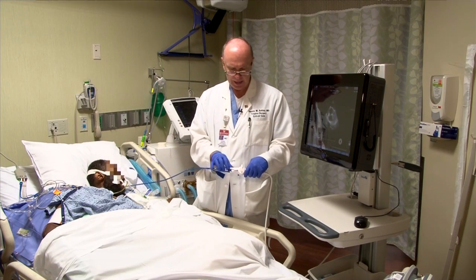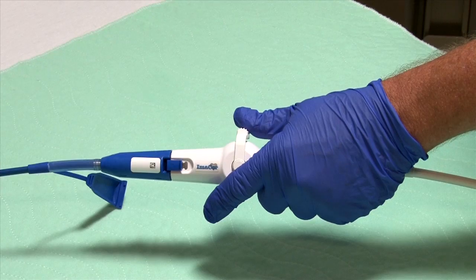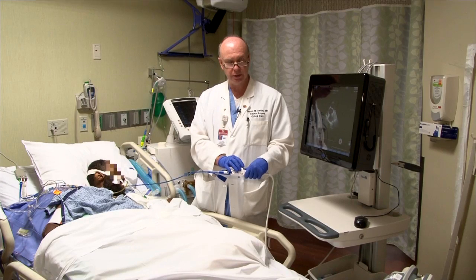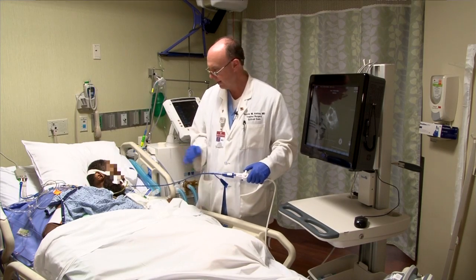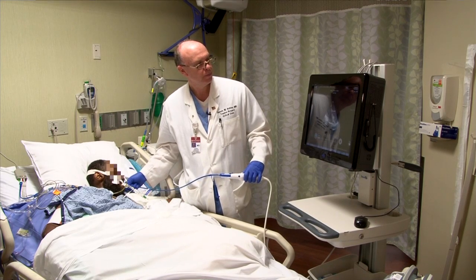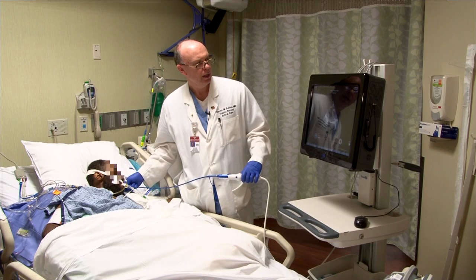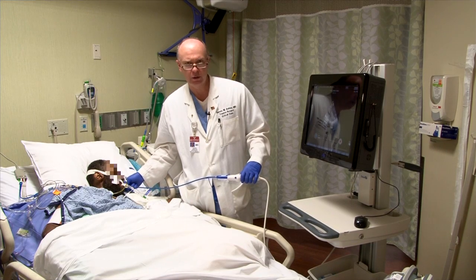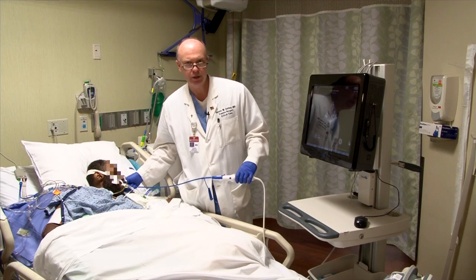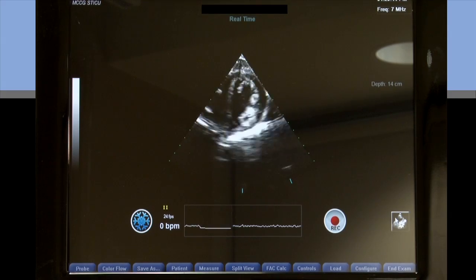I've brought the lever back into the neutral position. We don't want to insert or move the probe when it's not in the neutral position, so I've got it in a neutral position now. I'm ready to insert the probe into the distal esophagus, and at about 40 centimeters I'll go through the GE junction. Then I'll know I'm ready to start looking for the left ventricle, or the transgastric view.